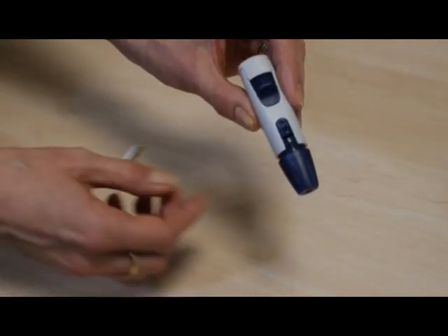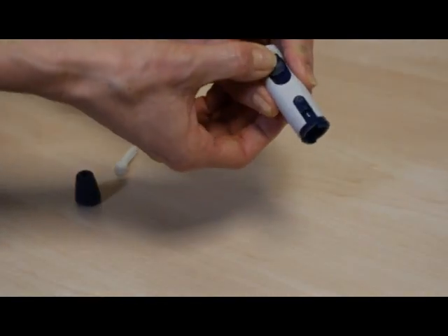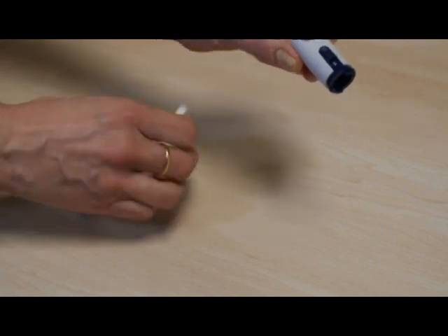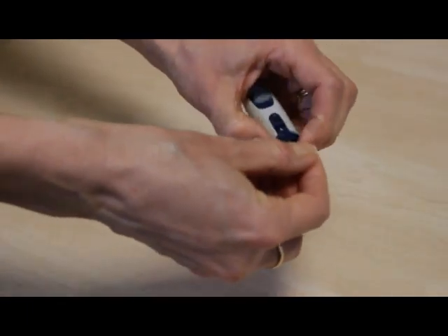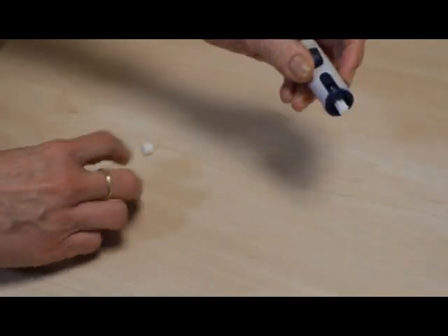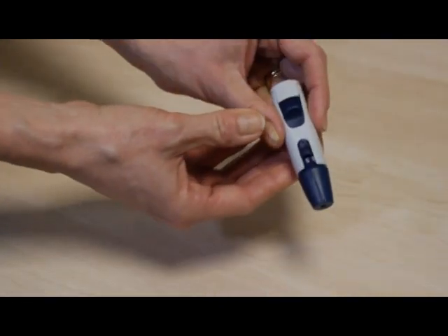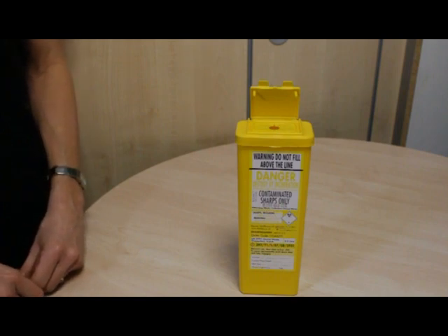There will also be a testing strip which fits into the slot at the end of the meter. Your finger pricker has a removable end cap and a release button. The lancet is fitted separately and the end cap is placed back on. The lancets should be disposed of safely into your sharps bin.